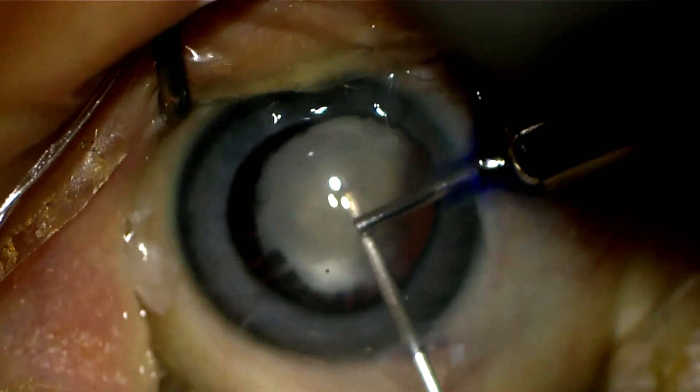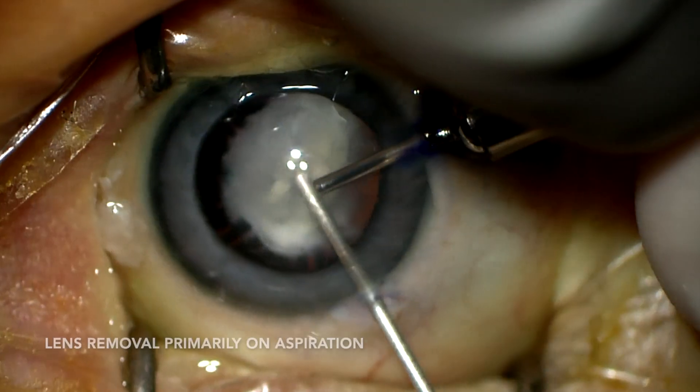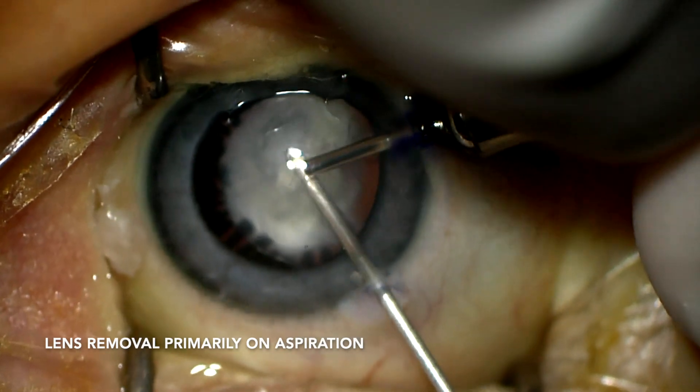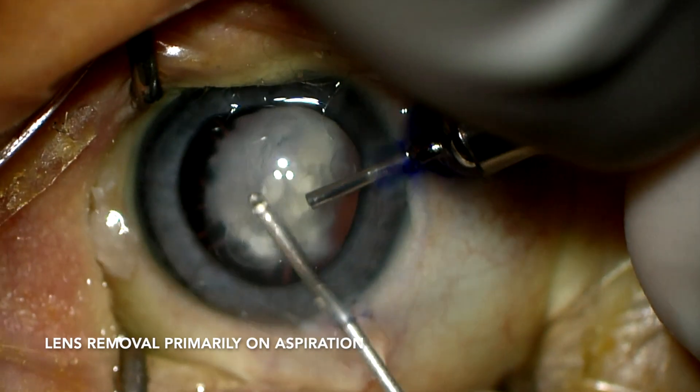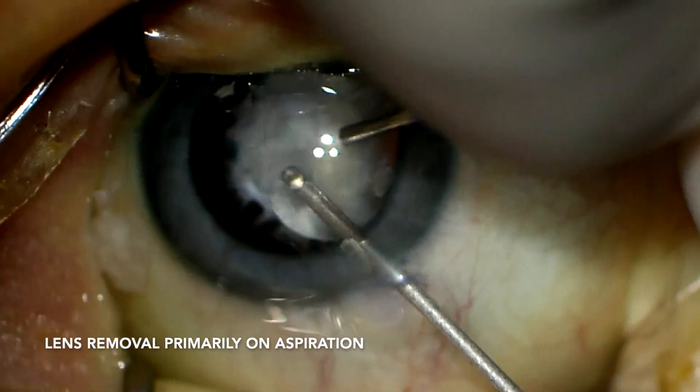The vitrectomy is used to make a central opening in the anterior capsule, only about 3 mm big, and the rest of the lens is taken with aspiration.